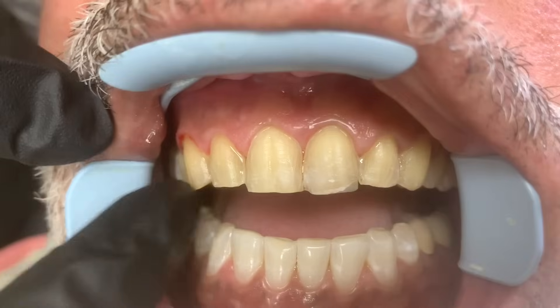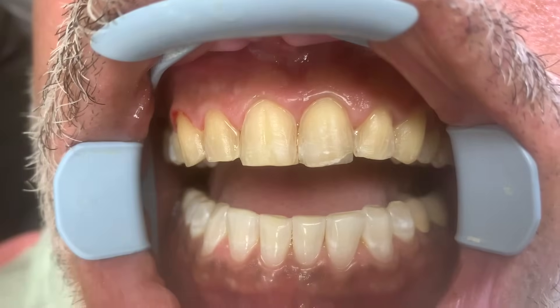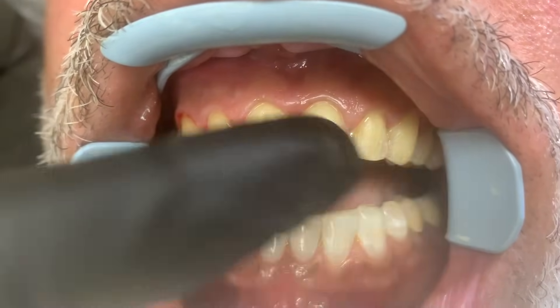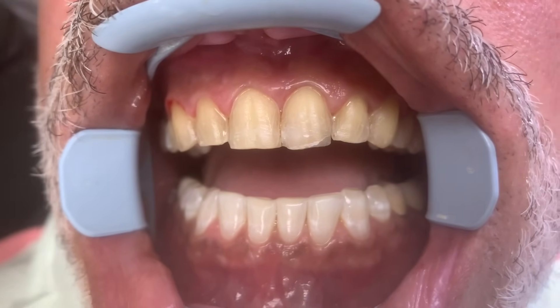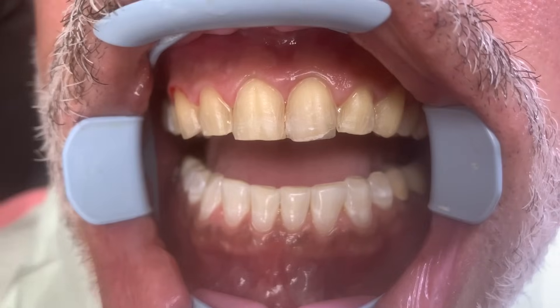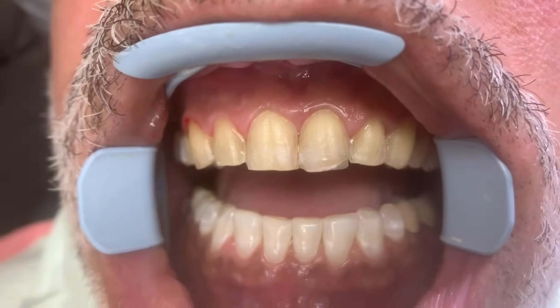We are veneering bicuspid to bicuspid — we're doing eight teeth on the uppers, not the lowers, and we're giving him a much more beautiful smile. He had had veneers in the past, but they had chipped. They usually last about 20 years, but you need to be wearing a night guard. We're going to go in and totally recreate a new smile for him.